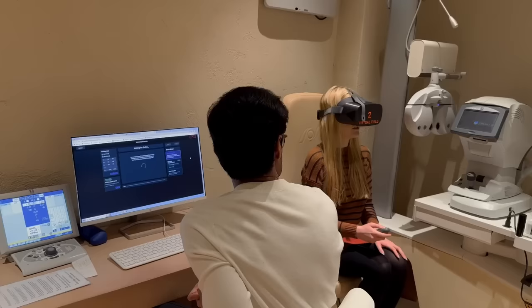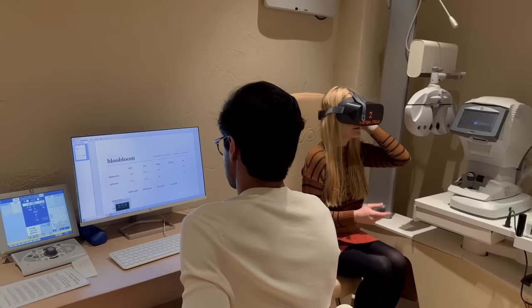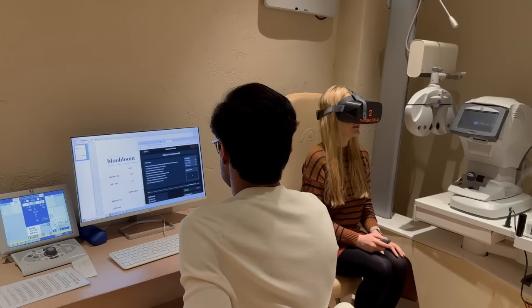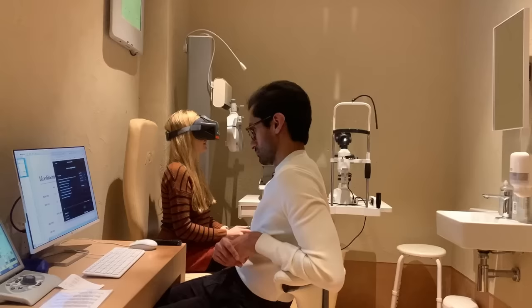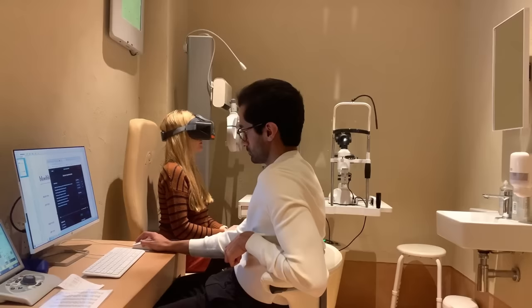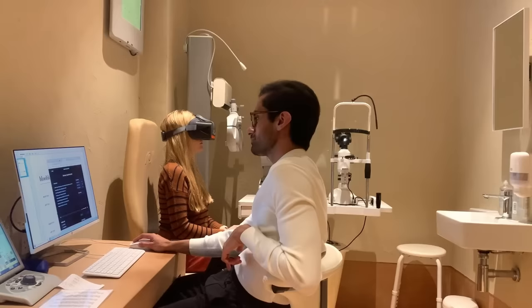Welcome. Do you see the green circle? Use your hands to move the headset so that the green lines are as clear as possible. Click when you're done adjusting. Great. In the upcoming exam, you will see small lights like this one flicker on the screen. Some lights will be bright, and others will be very dim. Click with your finger whenever a light is shown. Now, do you see the orange dot in the center? Keep your eyes focused on that dot until the test is finished. You can blink normally, but always look at the dot. Please ask a staff member if you have any questions. When you're ready, click to start the exam.